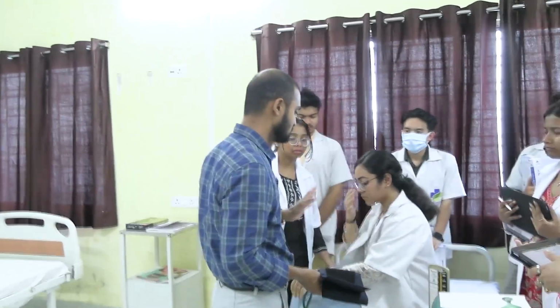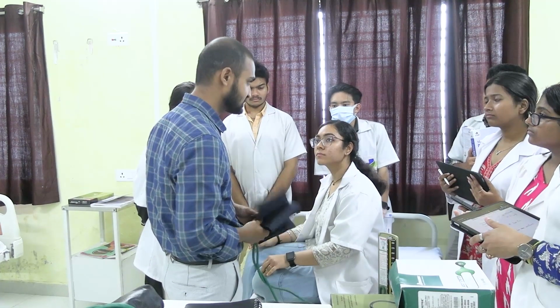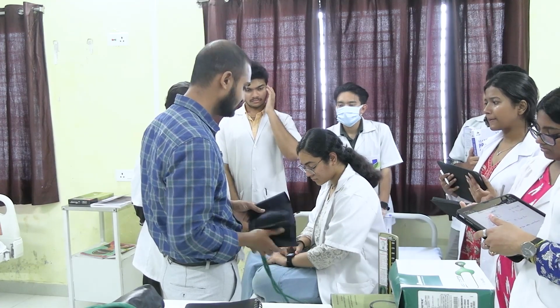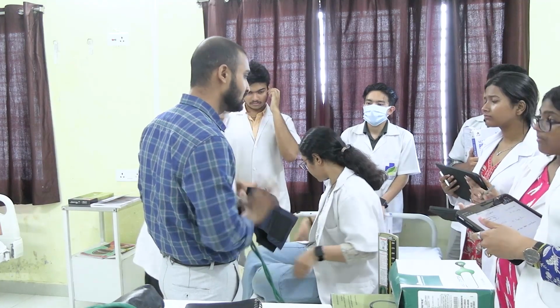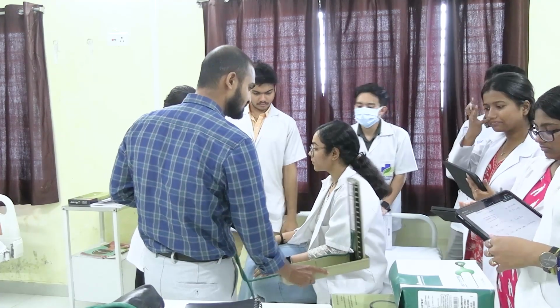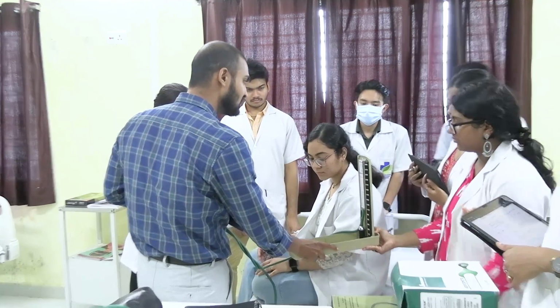Before measuring the BP of the patient, he or she must rest for at least 5 minutes. Then this BP machine should be at the level of the heart. Suppose this much. So someone hold it. So this should be at the level of the heart.